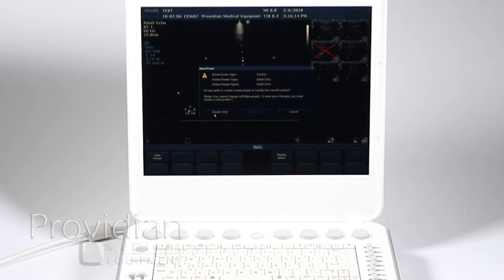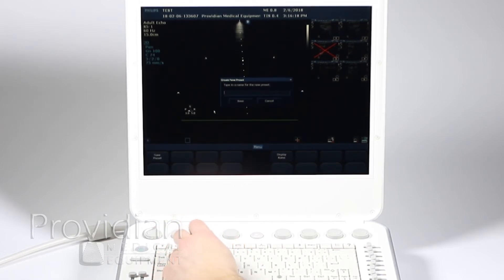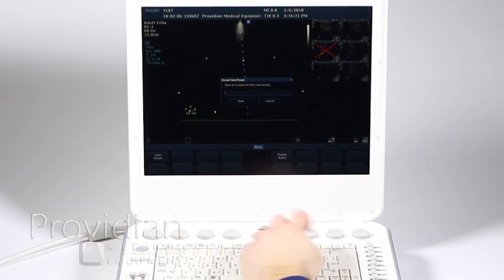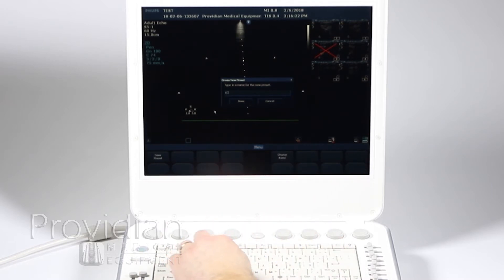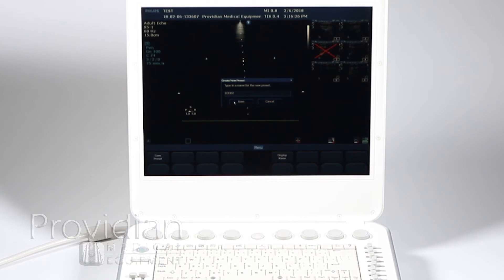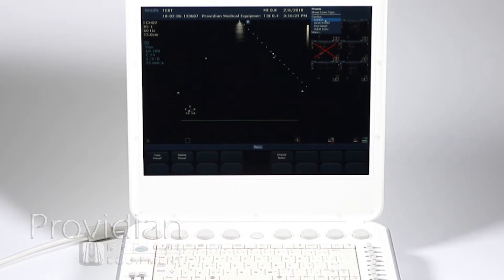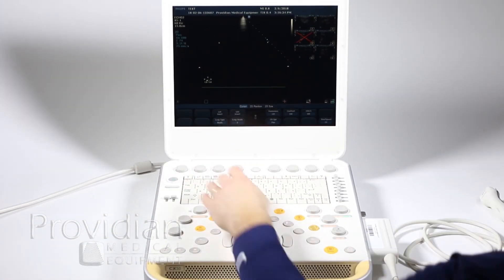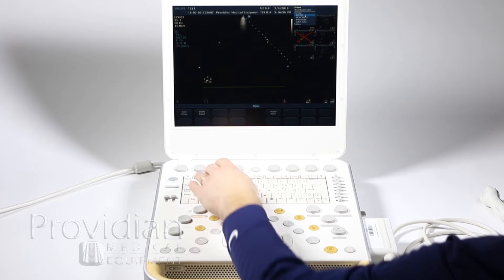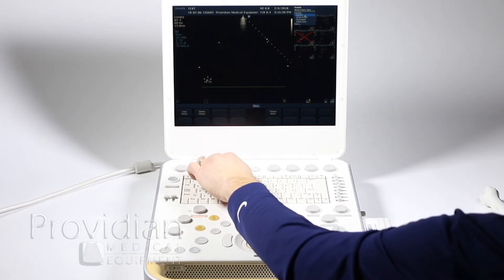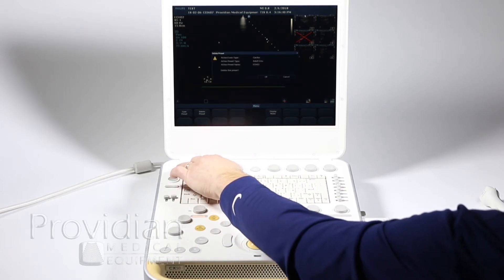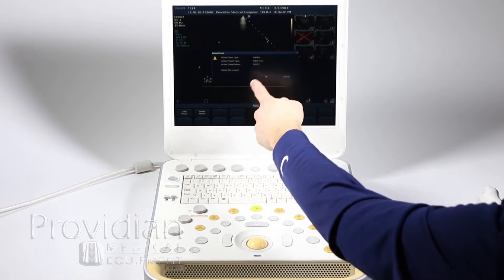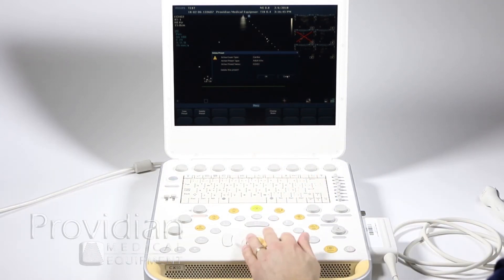The active preset name is adult echo. If I had a custom one there I'd be able to modify it but I cannot change a Philips preset. So I would create new here and I'll just type in echo 2 and click save. I can hit save and it's going to say are you going to delete or save depending on what I pressed.